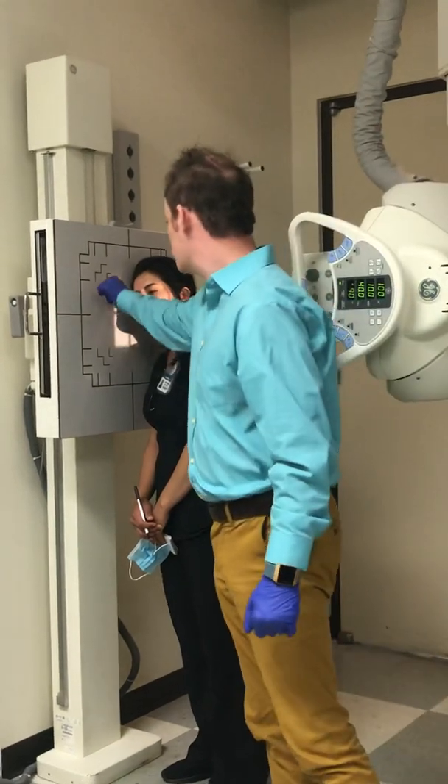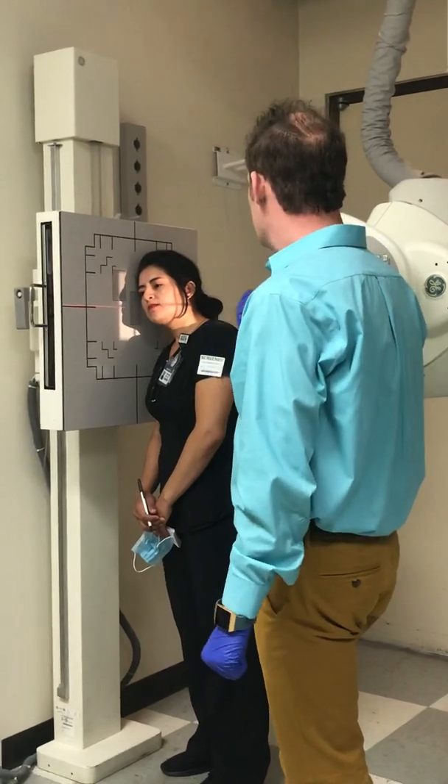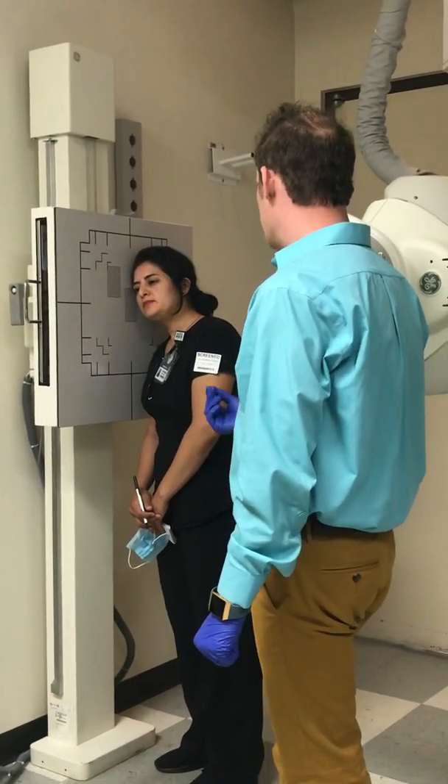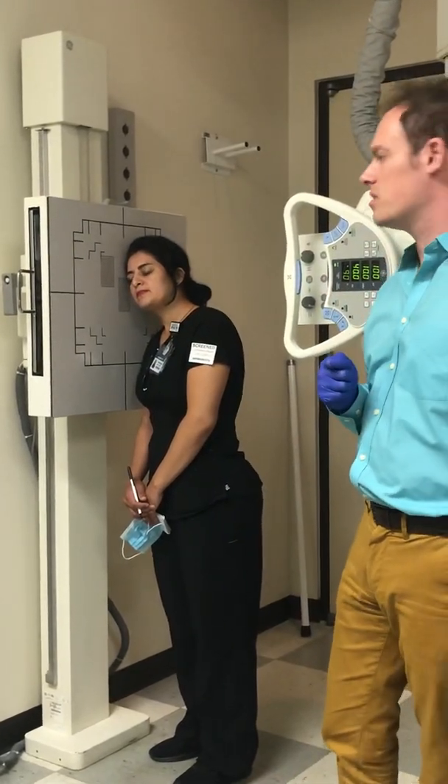The marker can go in the open space you have. Your patient is to hold very still as usual — don't move, don't breathe. Breathe and expose. And that will give you a beautiful axiolateral oblique general survey.